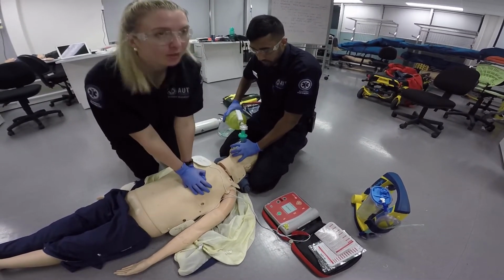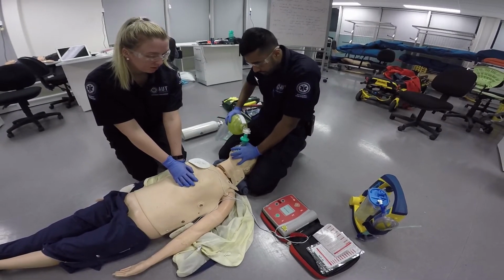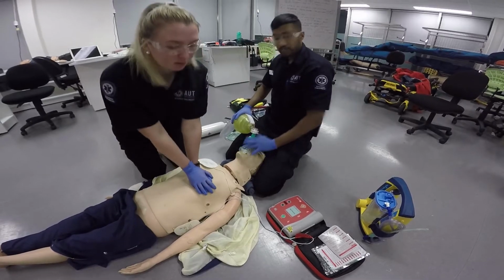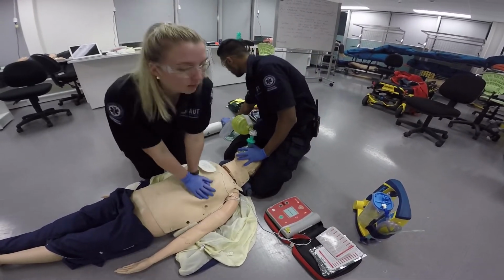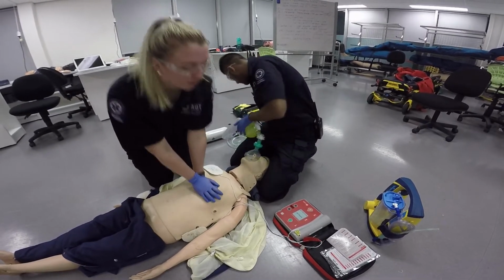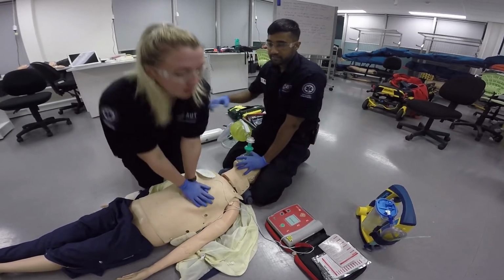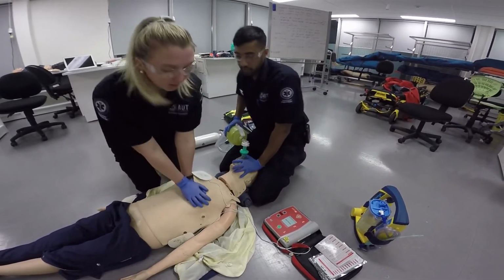25, 26, 27, 28, 29, 30. Alright, so I'm going to ventilate the patient looking for chest rise, using a C and an E grip. Good chest rise. Alright, next time the defib monitor goes on, Shawnee, we'll trade places towards the left, and then we'll trade roles, alright? Yep.